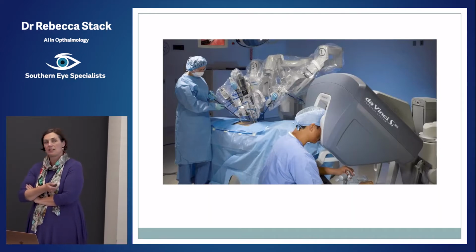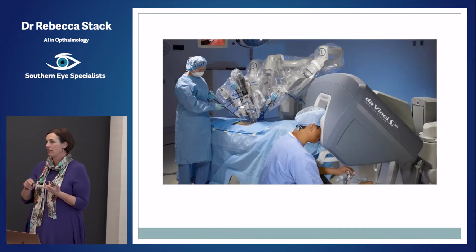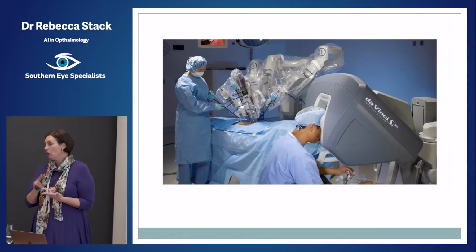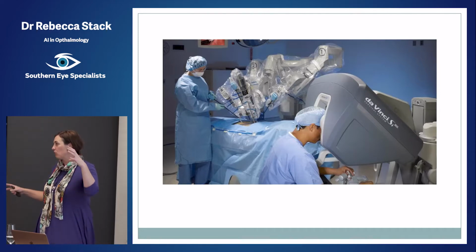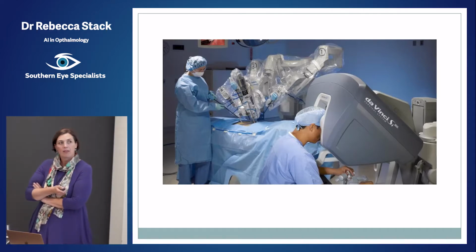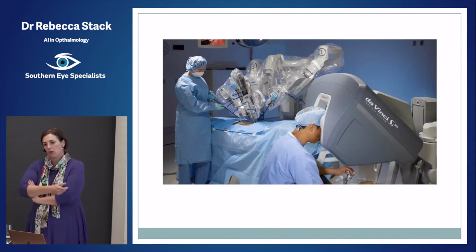There's several of these in New Zealand, and this is robotic surgery that's done for general surgery, so things like bowel surgery, cardiothoracic surgery, obstetrics and gynecology, well, gynecology, not so much the obstetrics part, lots of urological procedures, pediatric surgery, and the number of procedures that can be now done by robot rather than entirely human hand is absolutely enormous. So there's two different types of robotic surgery.